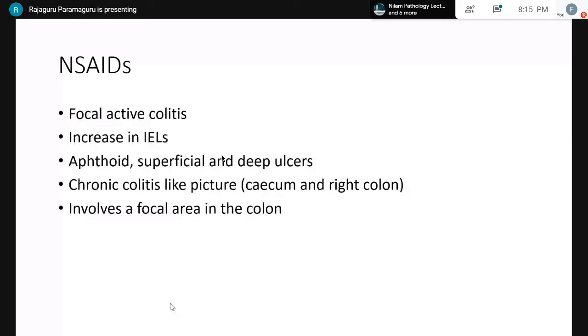The patient was a renal transplant recipient. While going through the literature, we found that even mycophenolate mofetil can cause some granulomas, similar to those of Crohn's, and the patient showed significant improvement. So this has to be kept in mind.